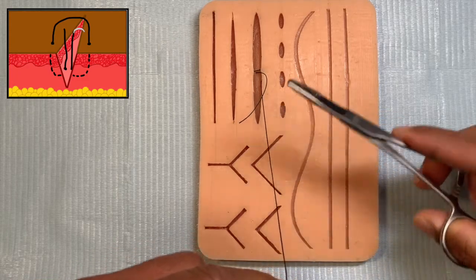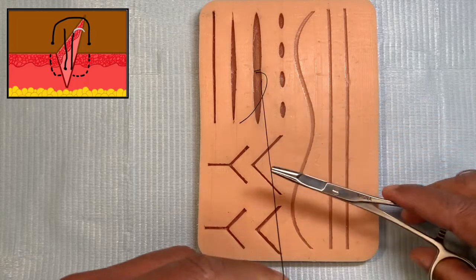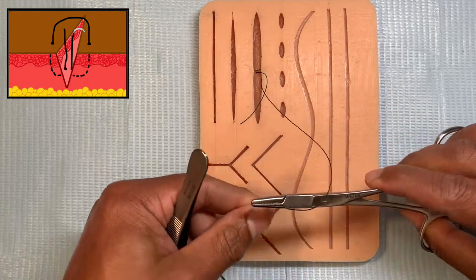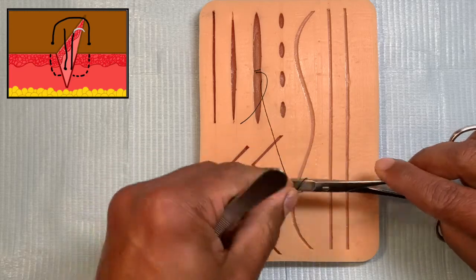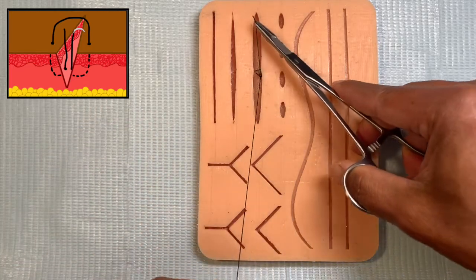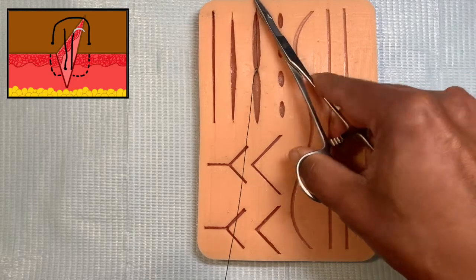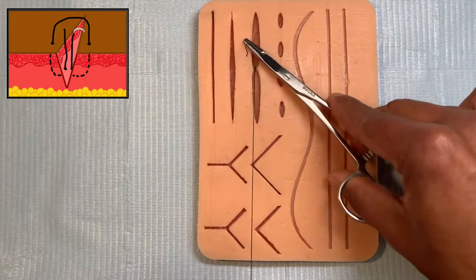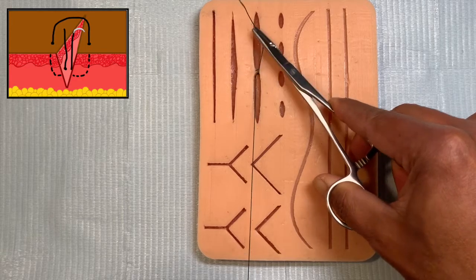And what I'm going to do here is rather than go forward because the way things lie, I'm going to go reverse two throws. Two, hold, and then you've got a surgical knot coming up here. And then you draw the edges together of this wound. So that's your first throw.